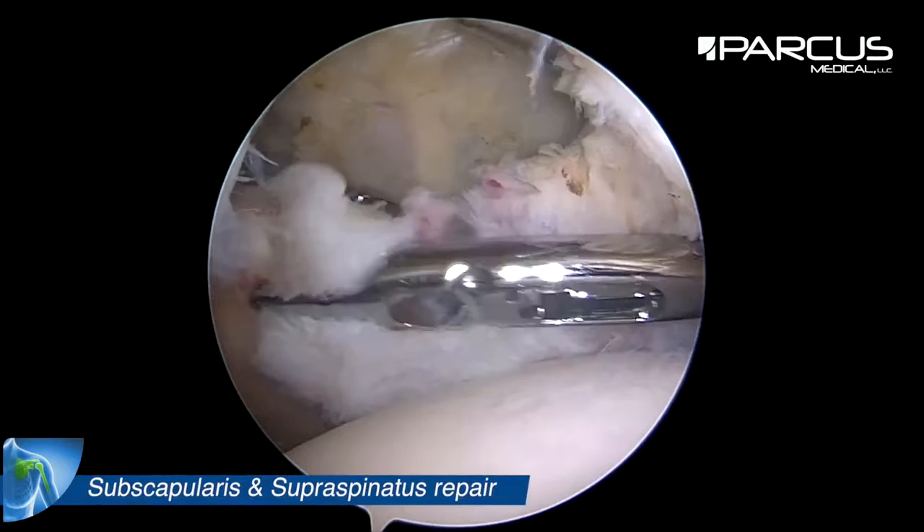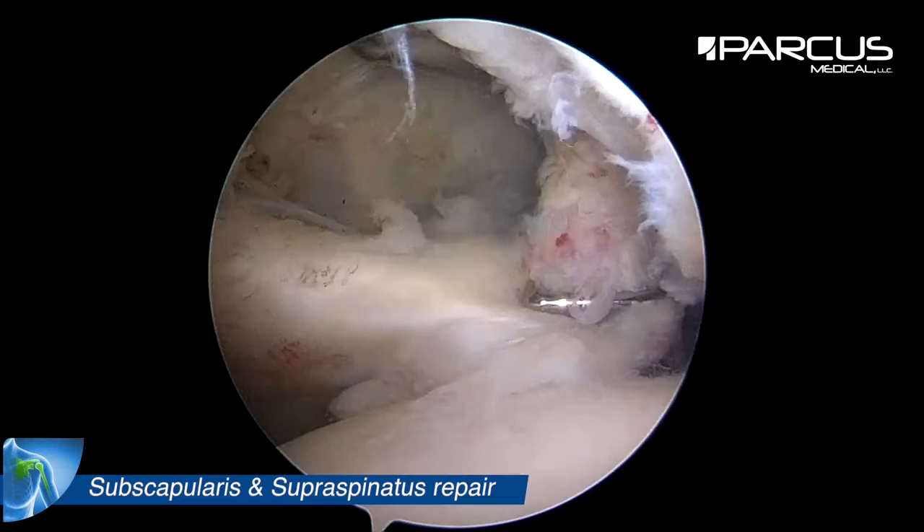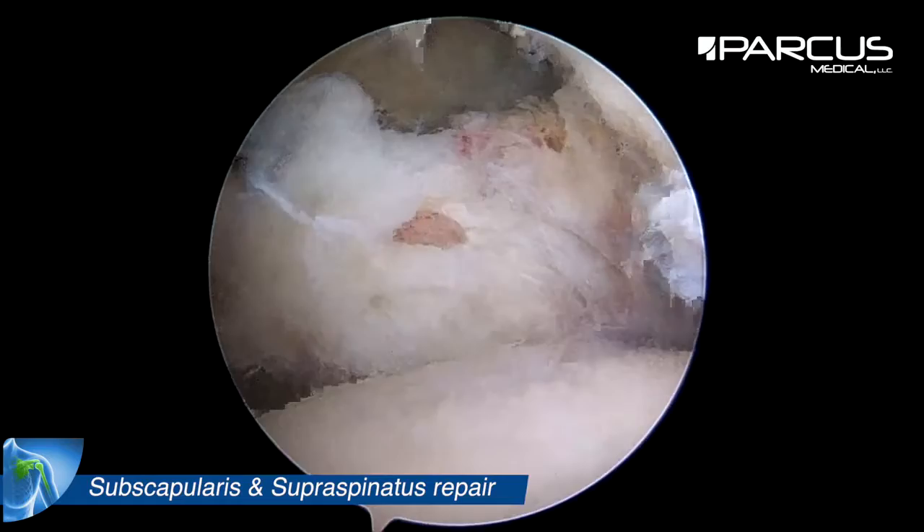Here we see the subscap tear and we check how it can be reduced on the lesser tuberosity using a grasper.